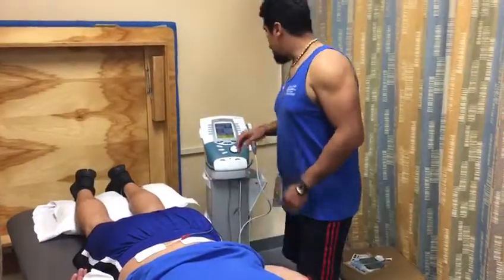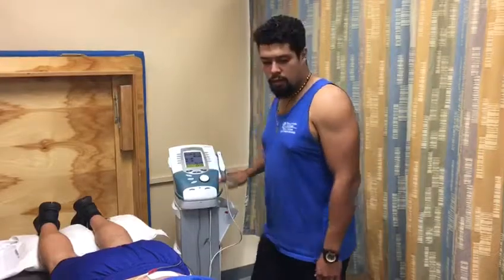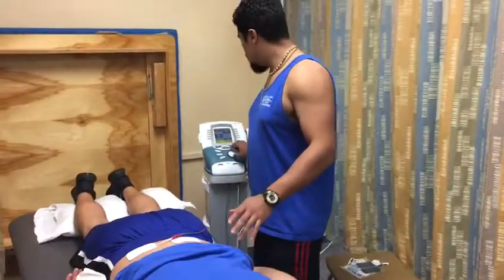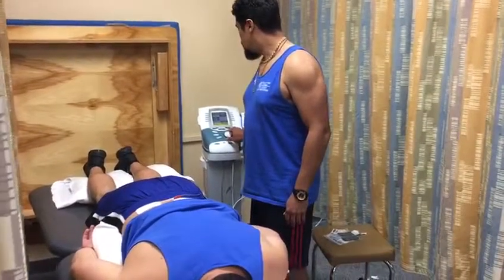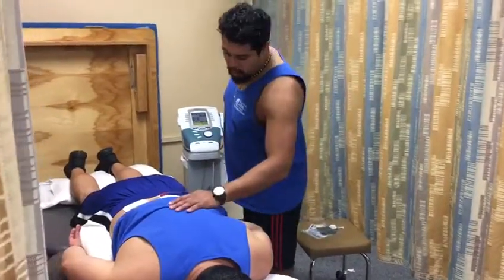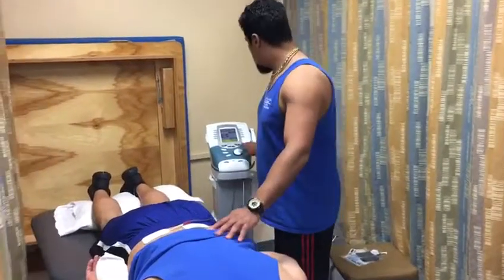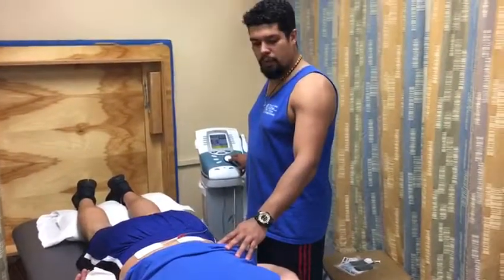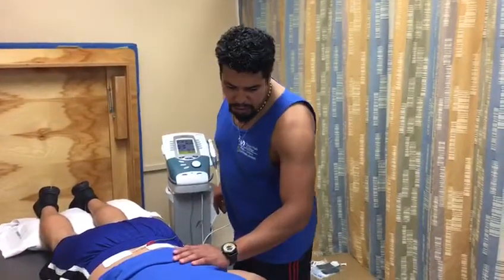Very good, and the parameters are going to be cycle time will be continuous and the time will be 15 minutes. Okay, Daniel, I'm going to increase intensity. Let me know when you start feeling it. Okay, you feel it? All right. I want it to be strong, but not to the point where it's discomfort. So let me know. That's good. Okay, very good. All right, I'm going to be coming back in 5 minutes to check on you.